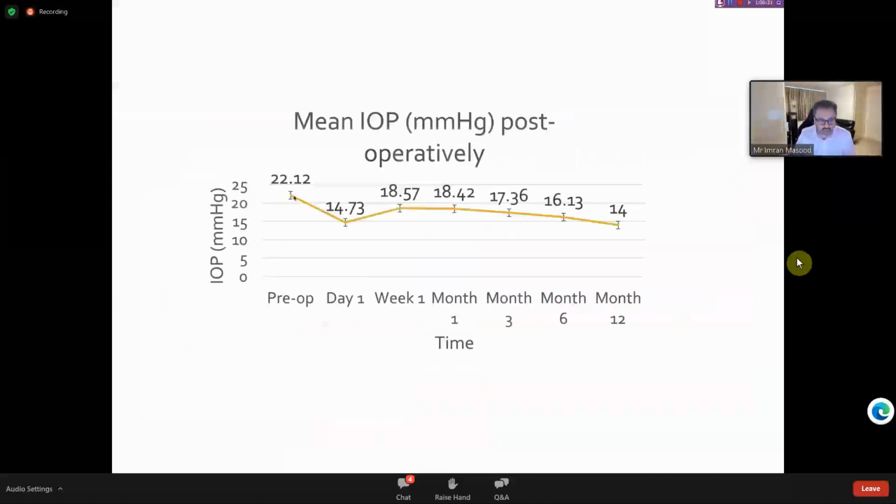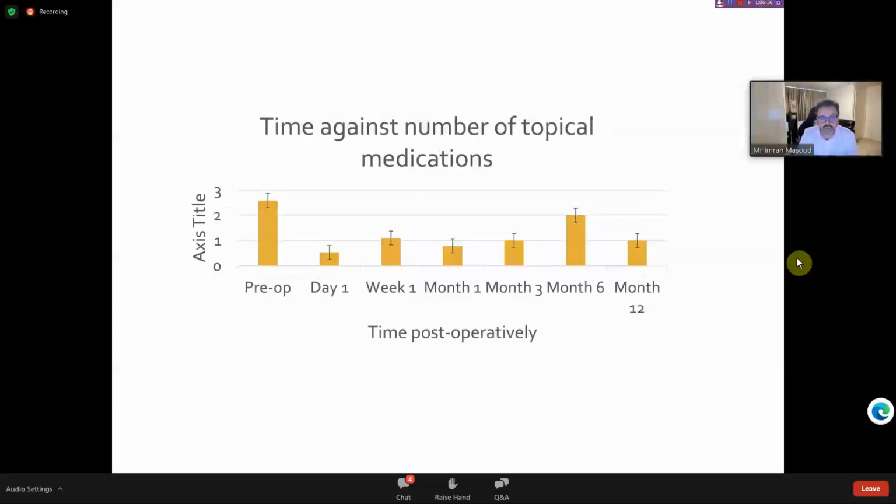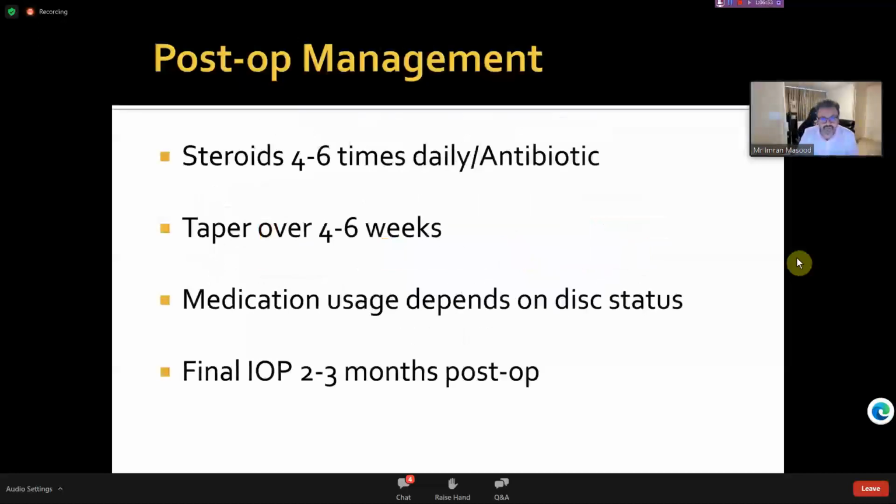We're almost towards the end now. This is a series of about 40 patients with phaco and iStent inject, and you can see at 12 months we're getting pressures down into the low teens. And I think with medication, you can get pressures down in the low teens with the iStent, and that's an important point. So you do have 2 categories of patients. You have patients where you want to get them off their drops, but you've also got patients with more advanced disease that you really want to get on reduced medication and better pressure control, so you can then filter them later on. And that's just the number of medications.